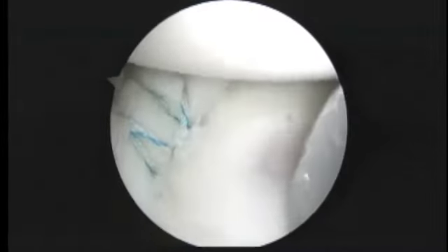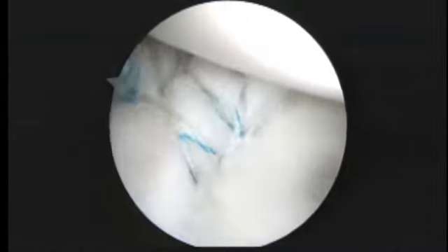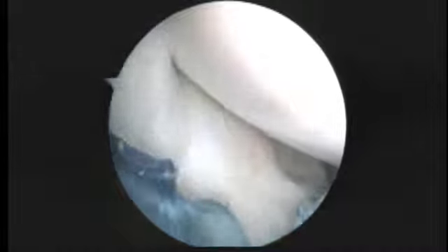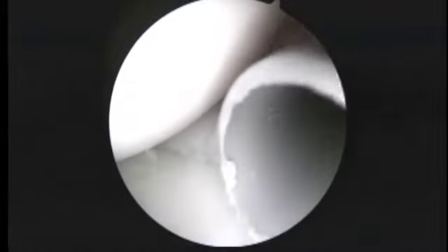Pause, please. Okay, so we've tied a second mattress stitch in the front. That's basically the equivalent of 4 sutures in the front, and I'm happy with the way that looks. Things are very snug now. I'm going to put the scope in the back one last time here to have a look at the cuff and see if there's anything I need to do, or if that was just part of the interval tissue.